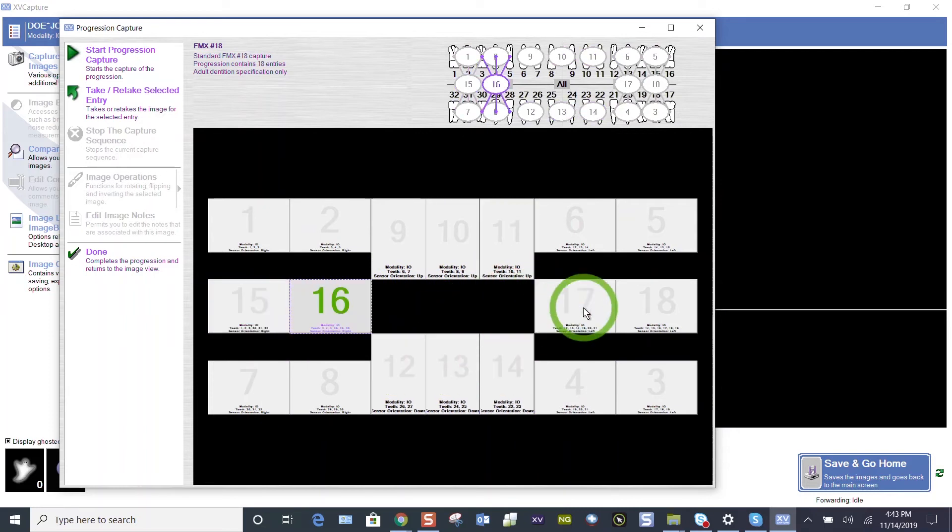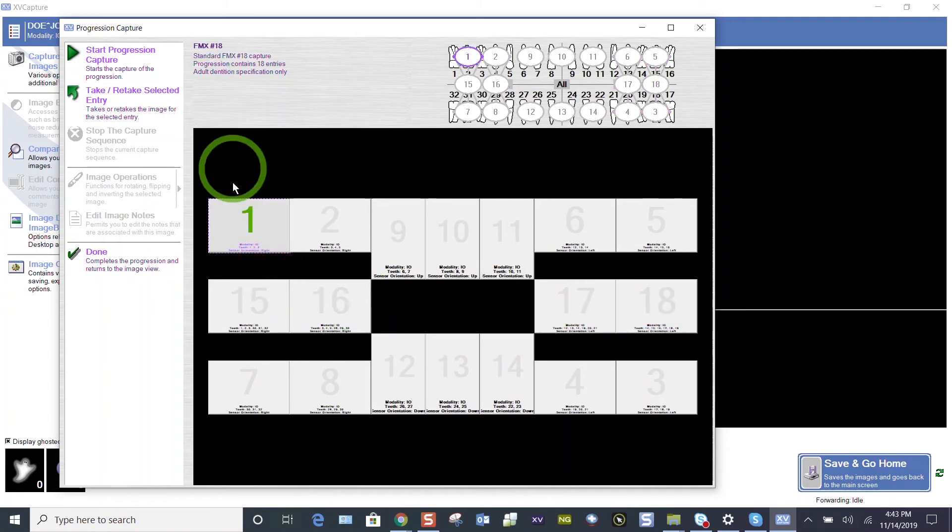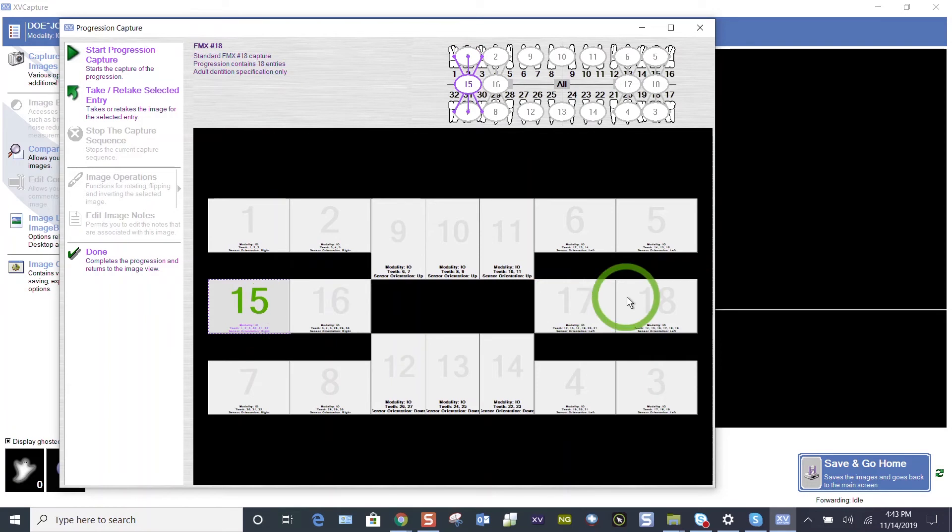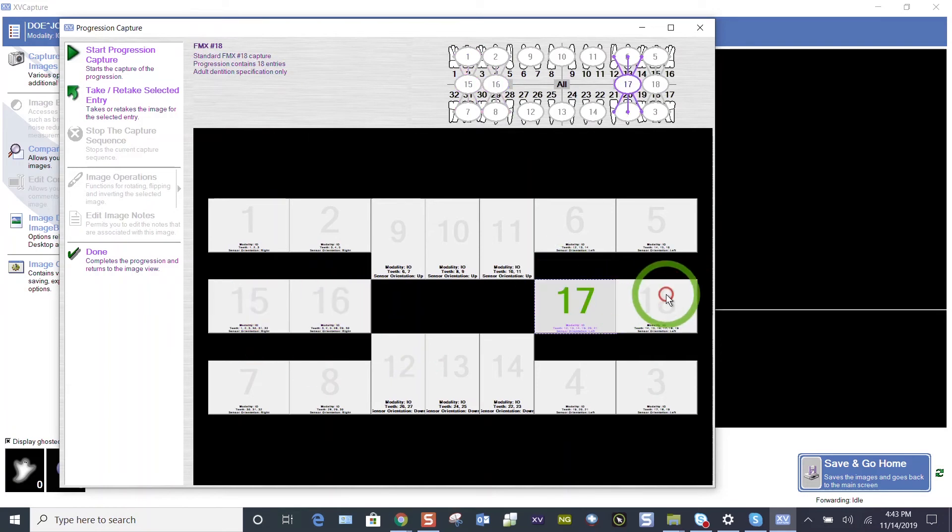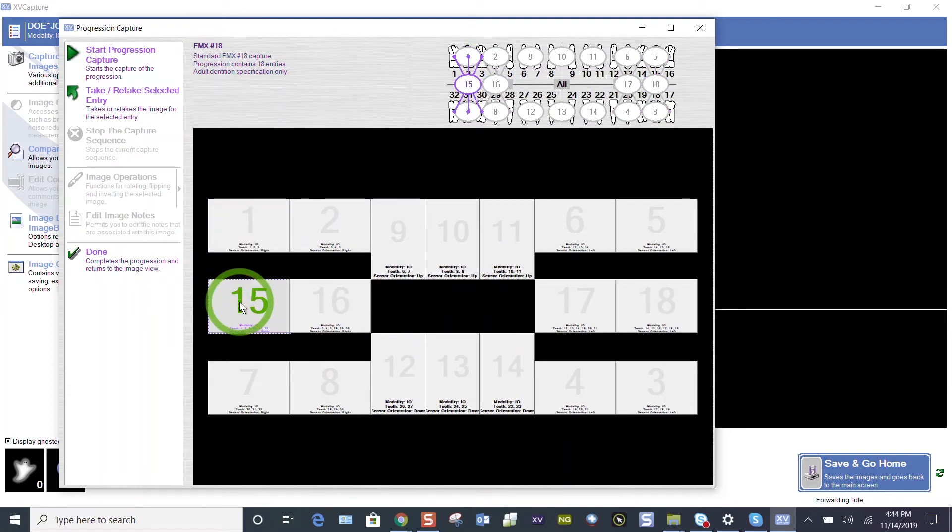However, if you like to take your bite wings first, the layout will always start on tile one. You see the name of the layout here in the upper left. If you want to do your bite wings first, that's great. Do those first. It's going to move 15, 16, 17, and 18, and then start again at tile one. Let's just do that. Let's just take the bite wings first.